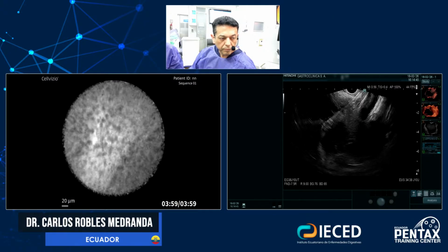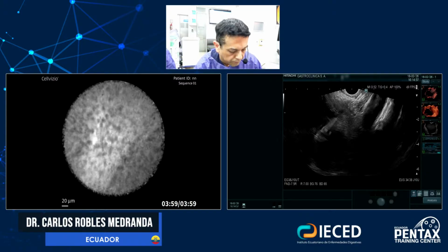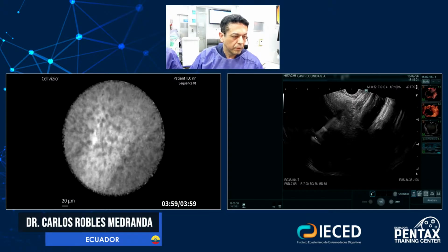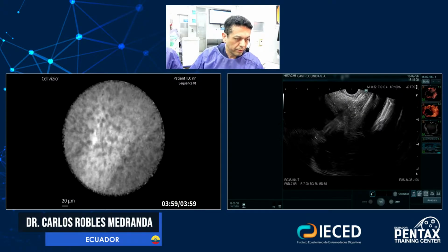Open. Close. Open. So you see the forceps here is open, you see? So now I'm pushing. Close. Now I have it, you see?